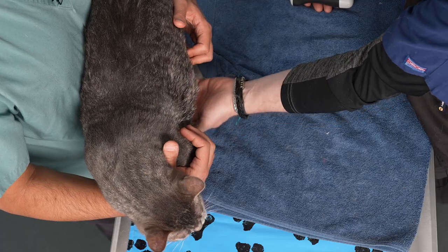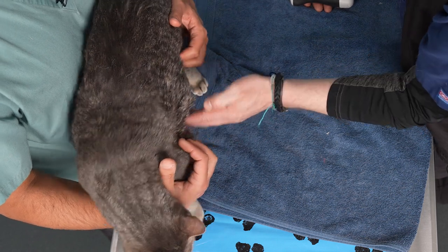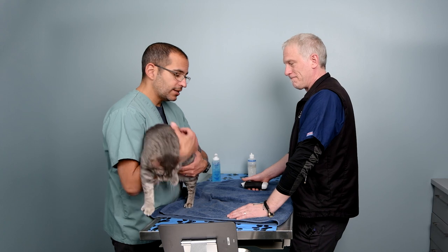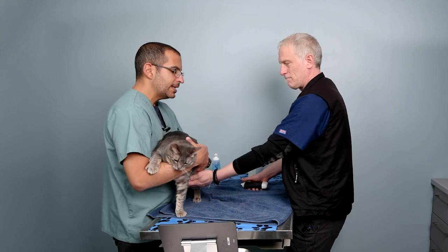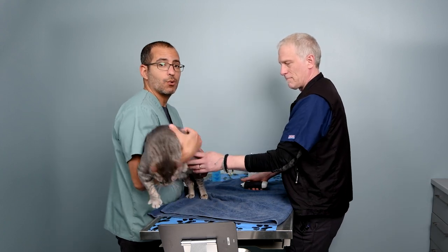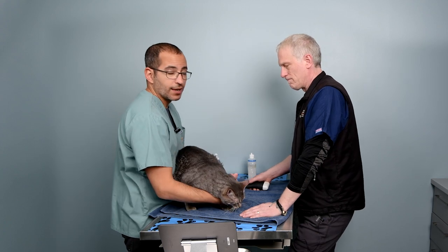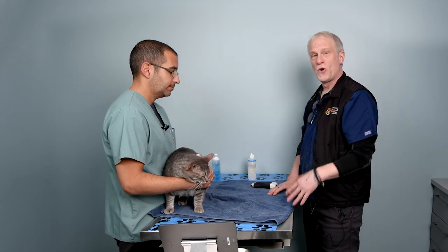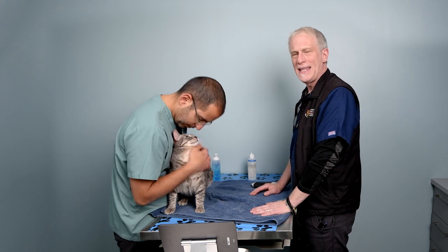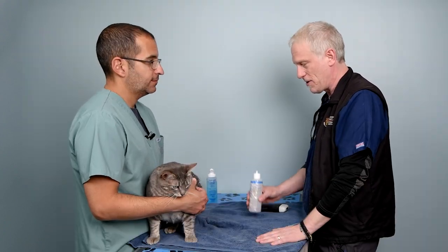Ventrally, we actually have two borders: the ventral lung border and the ventral pleural border. The ventral pleural border is going to be along the sternal muscles and the sternum. And then we have the cardiac notch, which is very important because that's going to be your ventral lung border. So we'll do a quick overview and show you how quickly we can scan the pleural space and lungs on our volunteer here, Daisy.